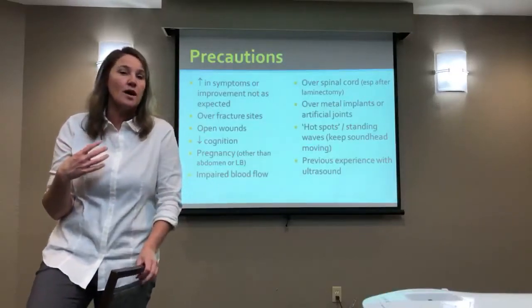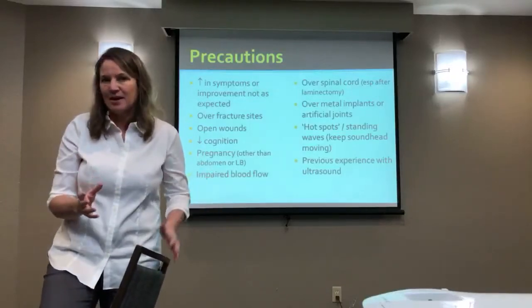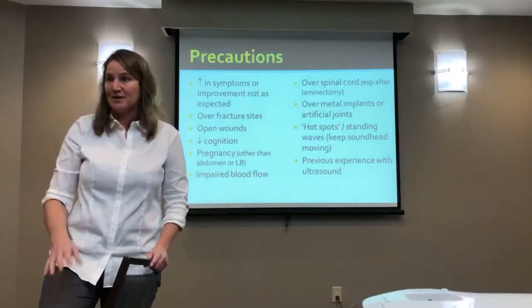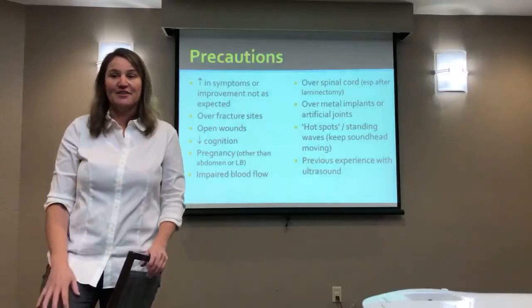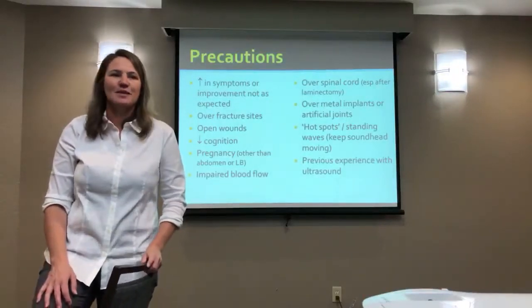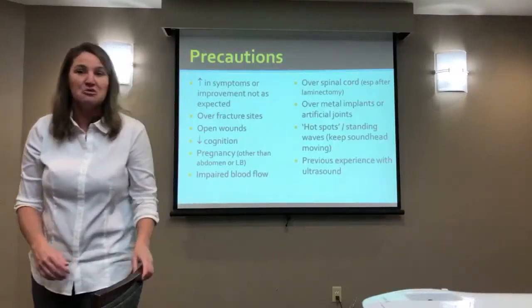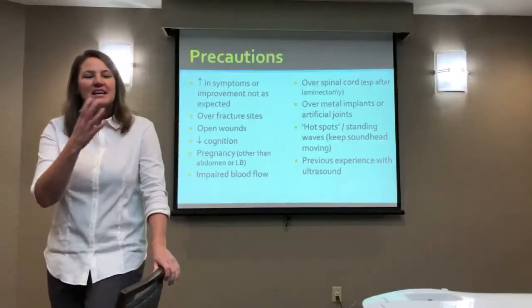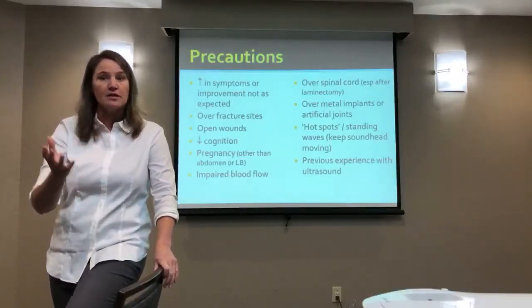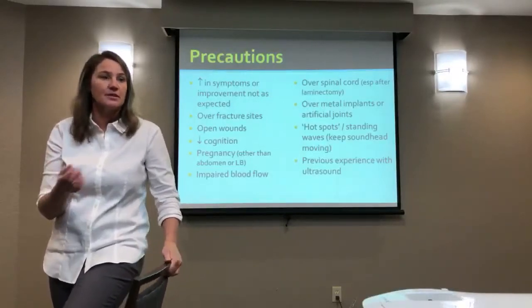I know that there was a while where our elderly population had been educated by Medicare that you report fraud and abuse, and I've had patients who were very, very questioning: what are we doing and why are we doing it, making sure that Medicare is getting its money's worth out of what you're doing, which is kind of cool. But again, if they have previous experience with therapy in general or a modality in general, like ultrasound, they may be questioning its value and whether it is something you want to use.